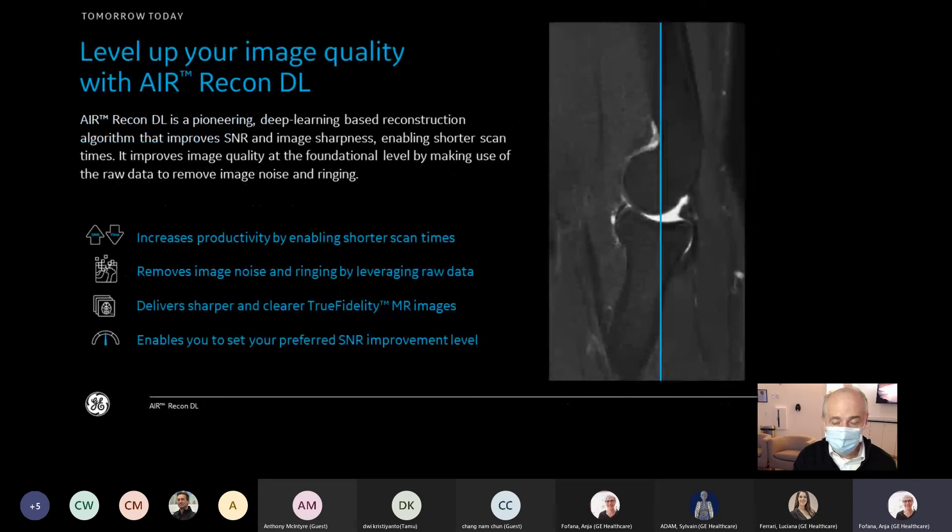One of the strongest features of the software is Air Recon DL — artificial intelligence and deep learning running directly on the scanner. Air Recon DL allows you to reduce or eliminate noise in MR imaging. By doing so, you can take advantage of protocol parameters to reduce scan times without worrying about excessive noise in the images. It also removes ringing artifacts by using a different type of reconstruction pipeline to improve image quality.